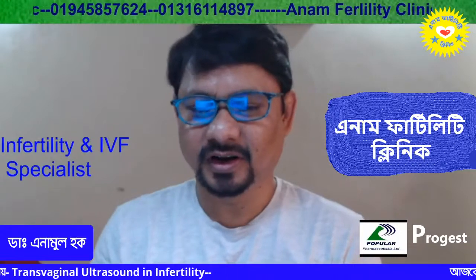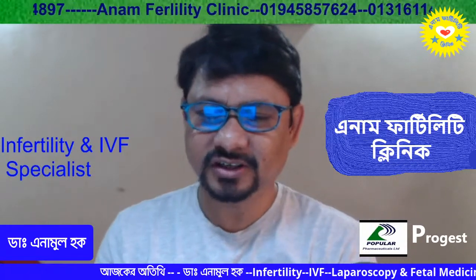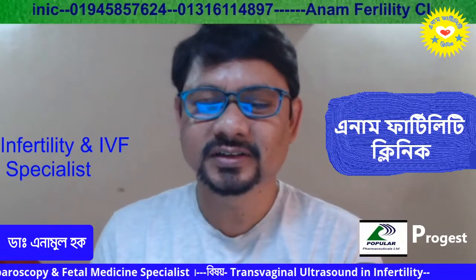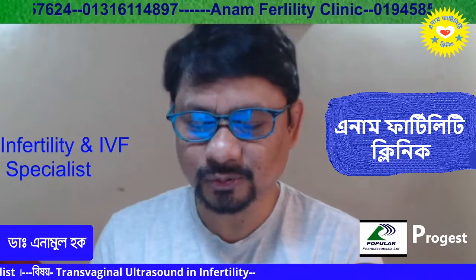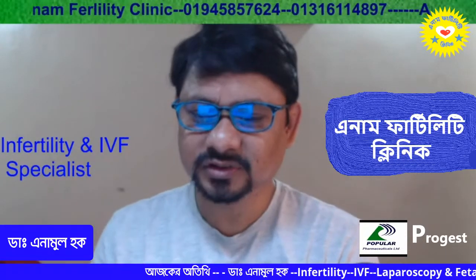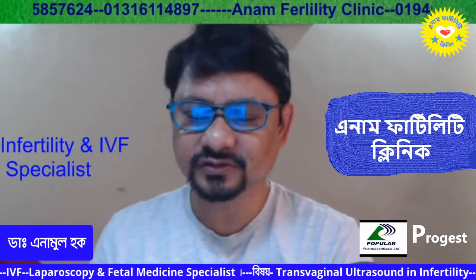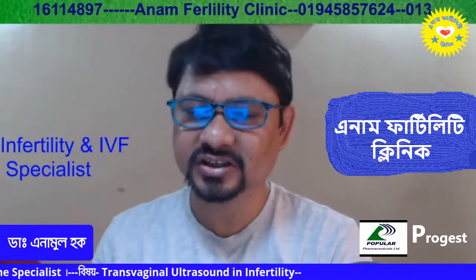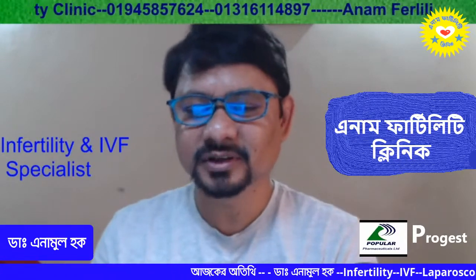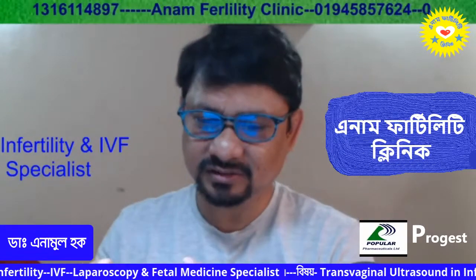Today, I will discuss the role of transvaginal ultrasound in infertility. As a gynecologist, I do believe that every gynecologist must know ultrasound, because it is the clinician who knows ultrasound who can correlate everything perfectly. So if the gynecologist does the transvaginal ultrasound, she or he can diagnose the problem in a better way, and thereby manage the problem perfectly. So you can optimize your success rate like that.